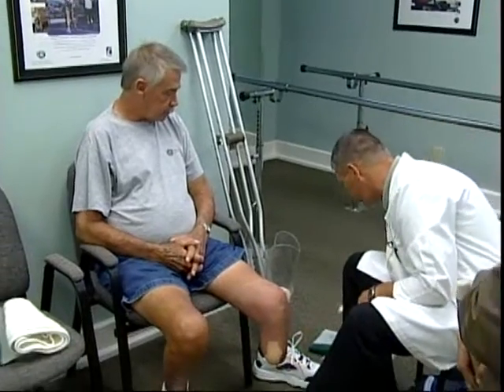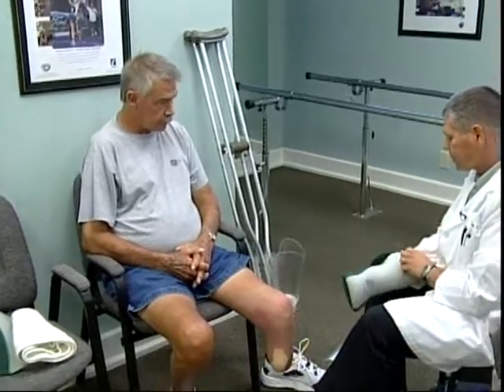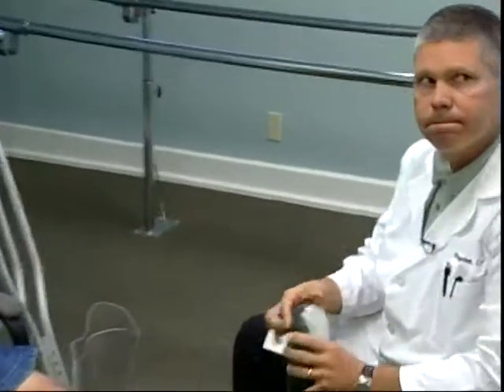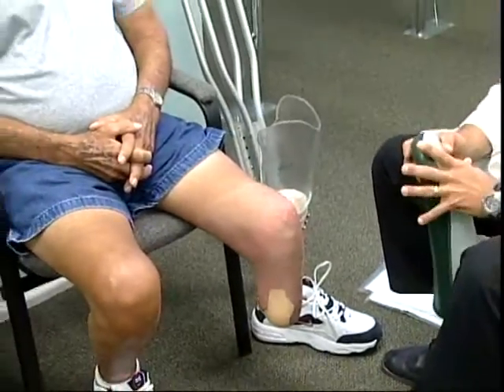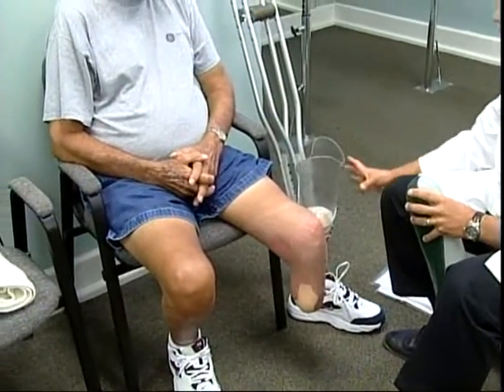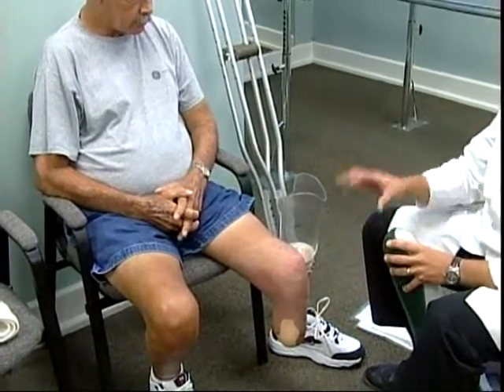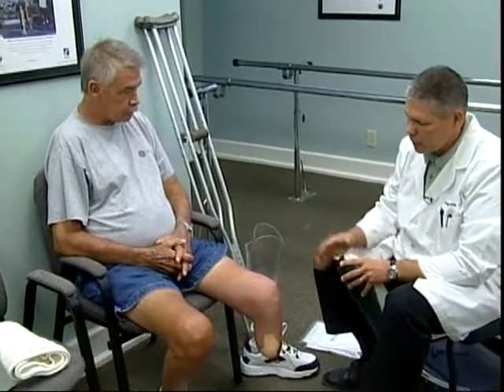The first thing we're going to do is just roll the liner in place. This is a cushion liner that we're going to use on him. Is there a vacuum he's going to have to push a button? Yes, he's going to have an electronic vacuum system that's going to be attached to the front of the prosthesis, and we'll see that shortly. He will manually flip the switch on, which will activate the vacuum, which will pull the prosthesis into the limb surface and keep it intact and in place. It reduces movement within the socket environment. It also helps to increase blood flow to his residual limb, and it helps with vascular flow as well, which is one of his issues.